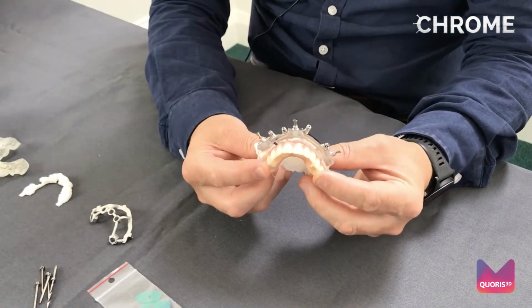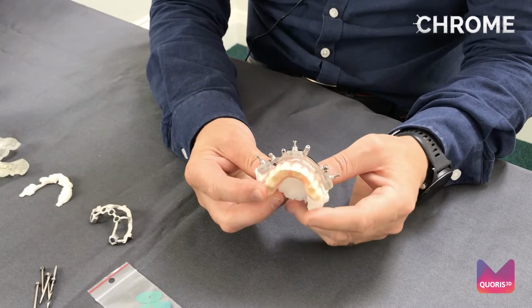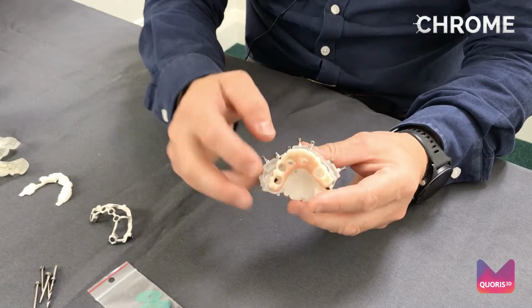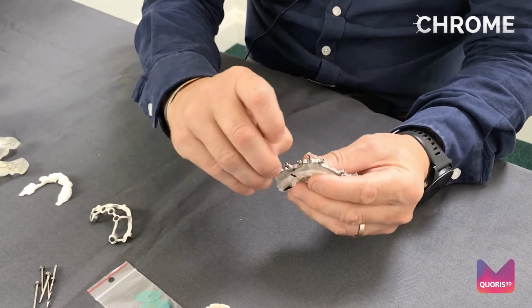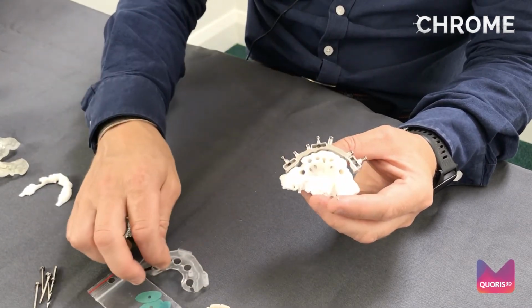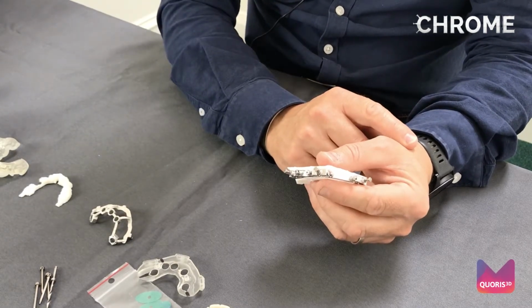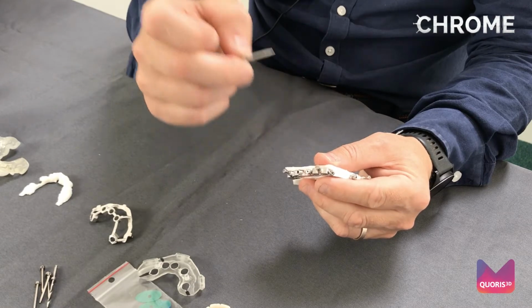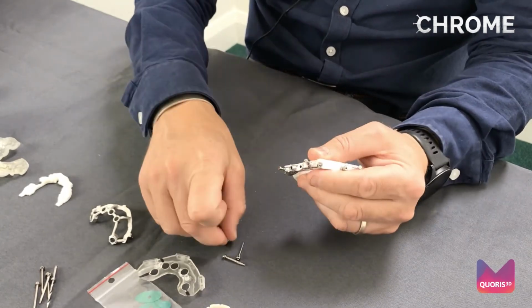Okay, so once the provisional has been picked up, you've all your temporary cylinders picked up and you're happy, then it's a matter of disassembling prior to suturing. So simply the prosthesis is removed, completed. You then unclick the 3 Swiss locks and remove your little carrier guide, and then you need to remove your fixation pins from your fixation base. This can be done simply by grabbing them with a mosquito or a little pair of forceps or something, but they're quite easy to be removed. And make sure you remove as many as you put in.